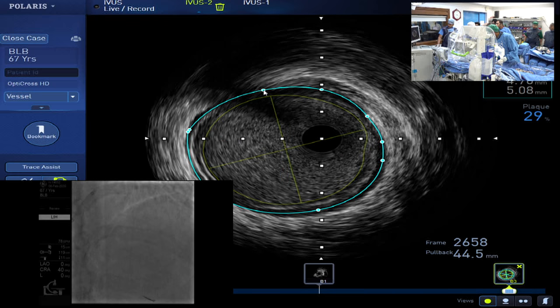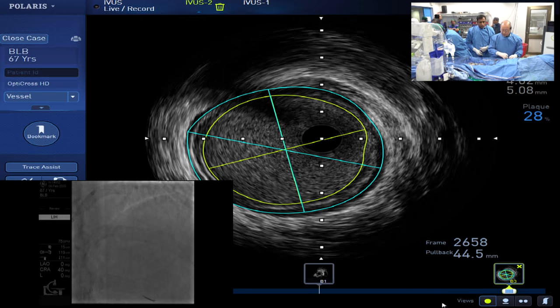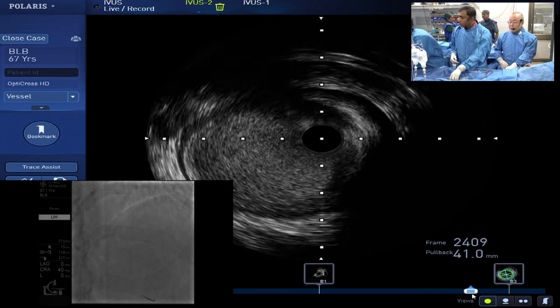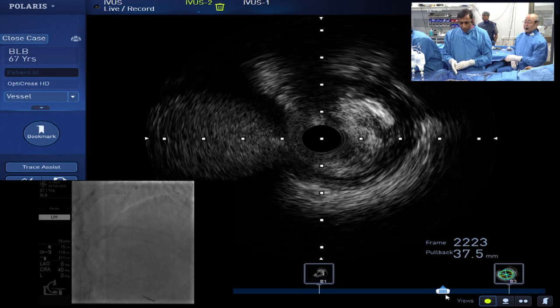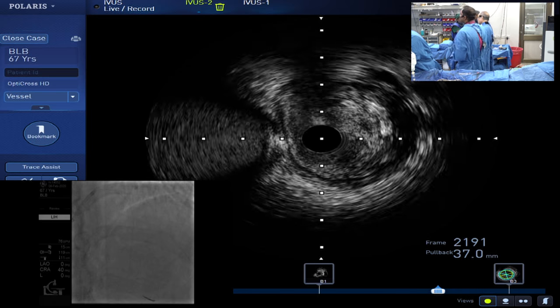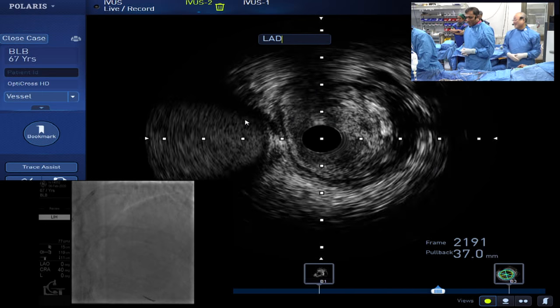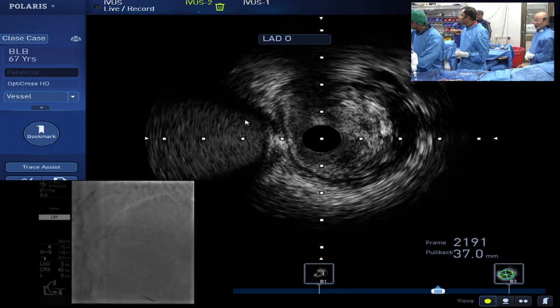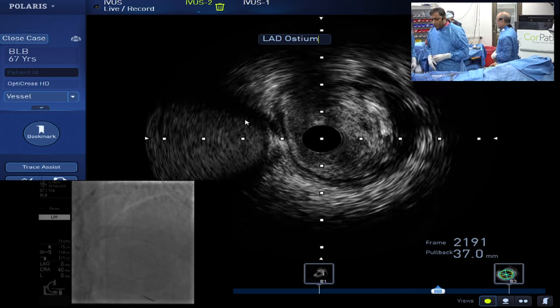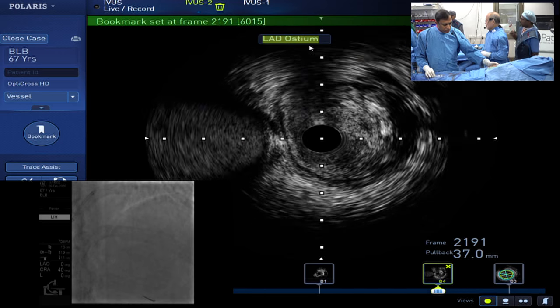Okay, in that case, I first want to take a 3.5, 38. Why not a Szabo technique to just stent from the ostium of the LAD rather than going from left main over LAD? If I am skillful like you, I can do it. Here it is, the LAD angle is 90 degrees and the circumflex is straightforward, ramus is there. Okay, caudal.